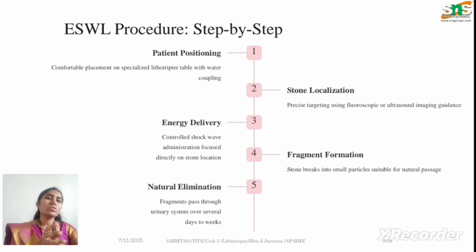Then the second step is stone localization. We have to identify where the stone is, whether right or left, or the exact location. We have to predict this before sending any sort of energy source. We can locate it with the help of a visualizing system. We have ultrasound imaging, or you can even use X-ray systems. And then energy delivery. Once the targeted area is fixed, we will go with the energy delivery.